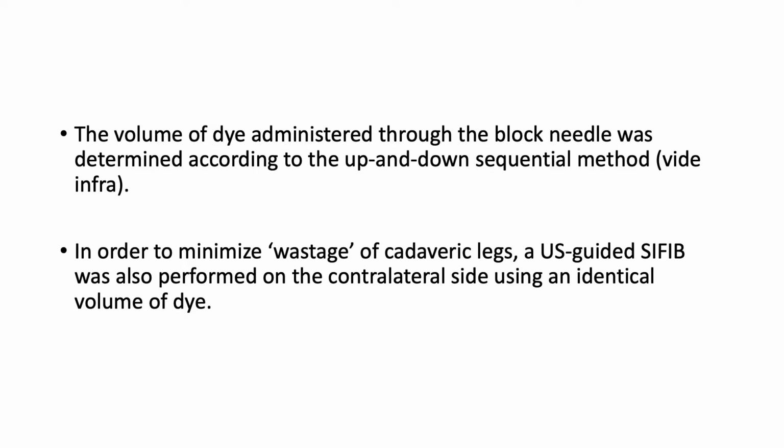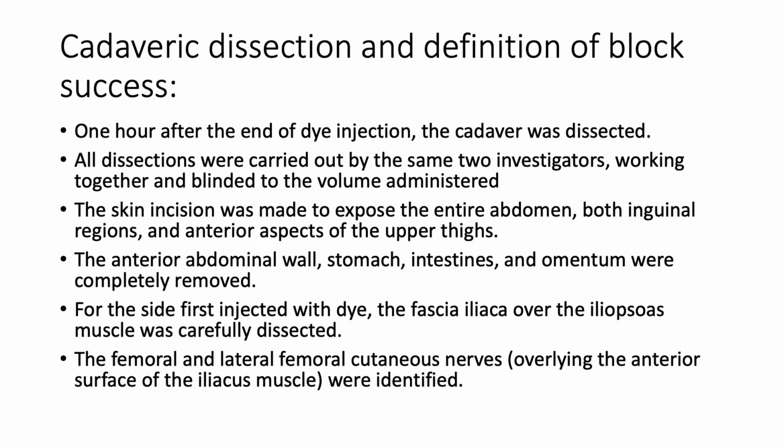So in order to minimize wastage of cadaveric legs, ultrasound-guided suprainguinal block was also performed on the contralateral side, but they used the identical volume of dye compared to the other side. So, cadaveric dissection and definition of block success. One hour after the end of dye injection, the cadaver was dissected. All dissections were carried out by the same two investigators. They worked together and the volume administered was blinded.